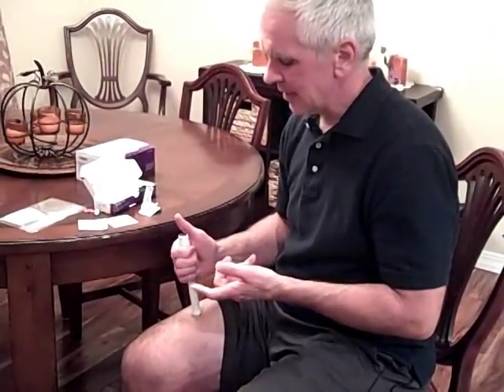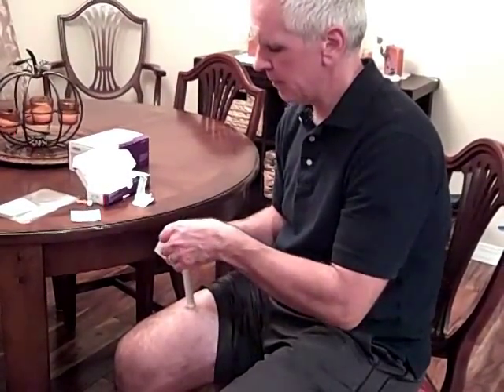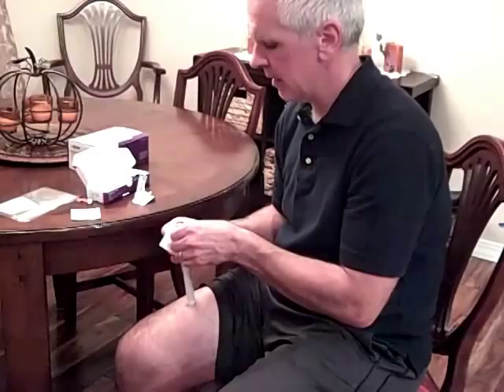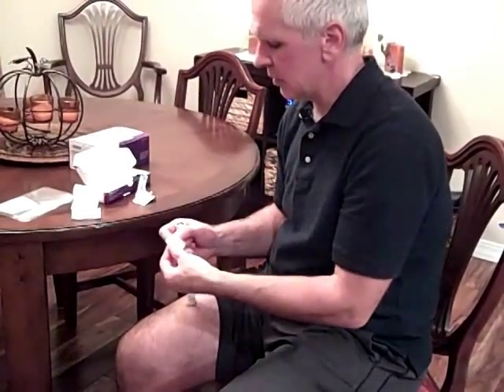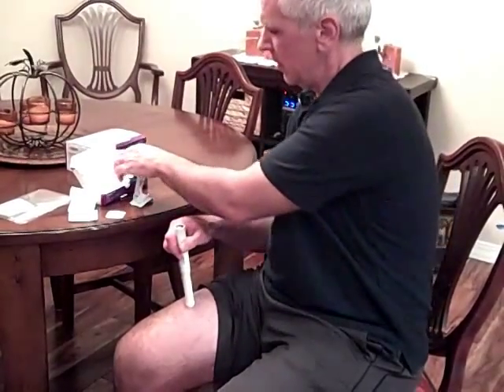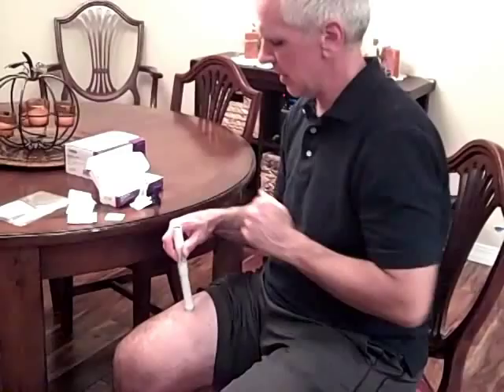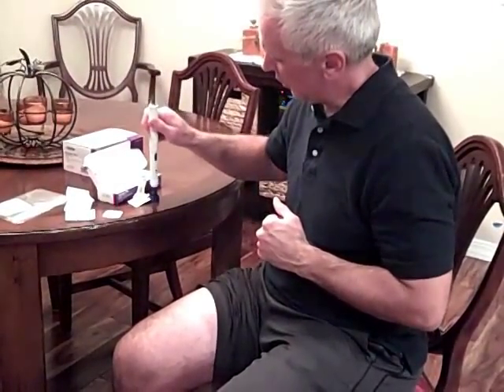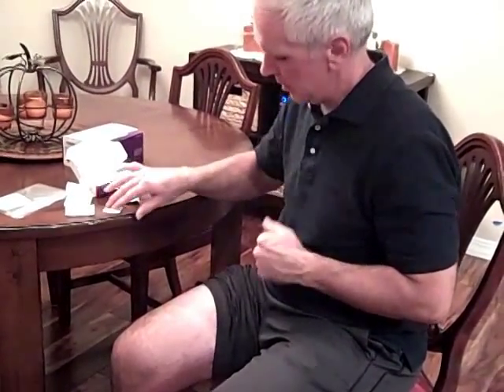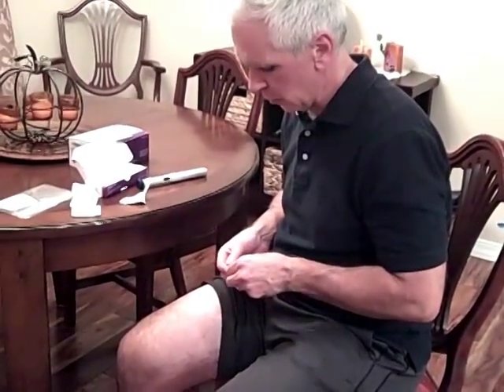You're supposed to count to ten. While I'm doing that, usually I'll open up a band-aid just to have it handy. The gauze is here just in case I bleed more than I like to. I'll take my little storage device and set it up right here, and I can put the used thing right in there. I'm not bleeding very much — otherwise you'd use the gauze to put pressure on.